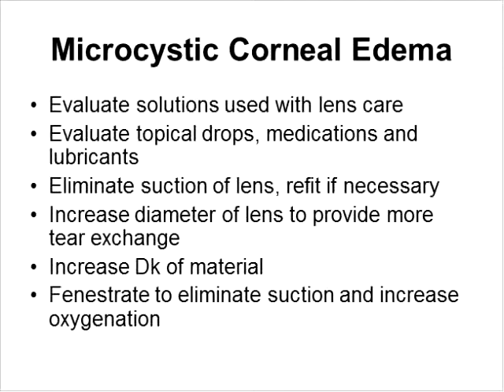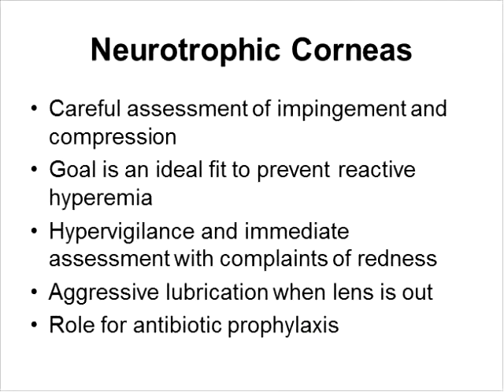And you can increase the diameter if you're running into suction, because that will provide more tear exchange because of the asymmetry more peripherally from the cornea. Increase the DK of the material, and you can fenestrate to eliminate suction and increase oxygenation.